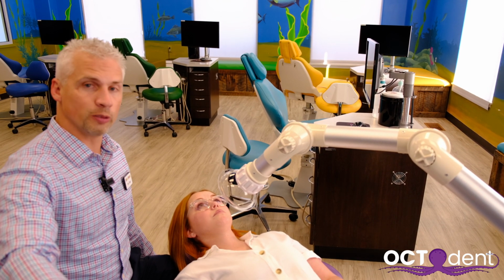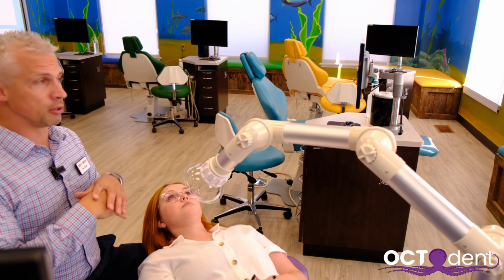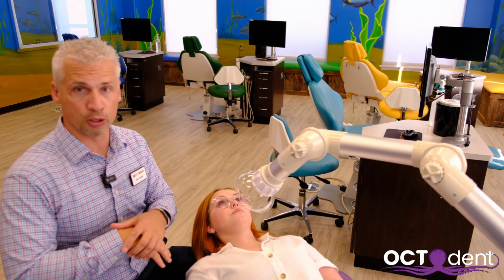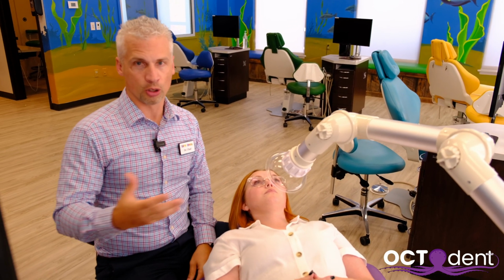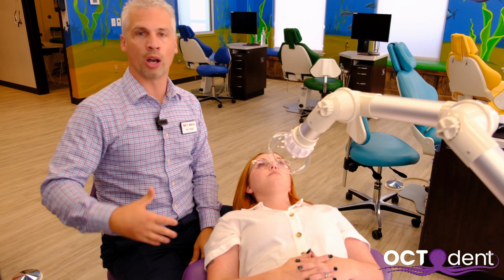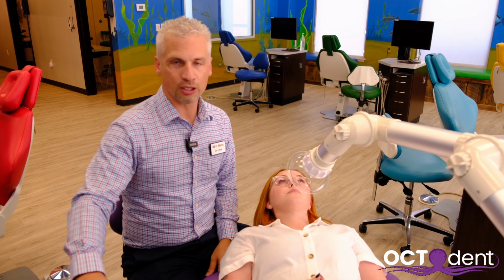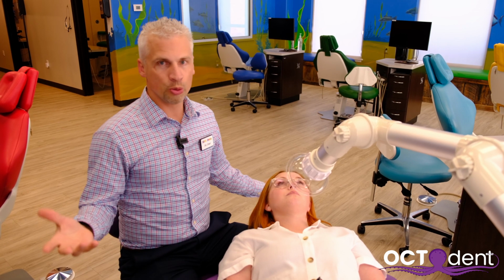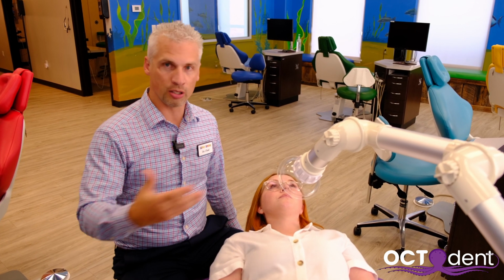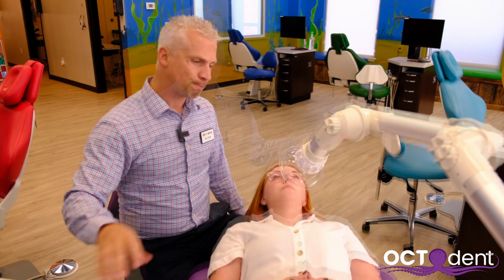So it's just sitting over here with my barrier, and then I'm able to fill the tooth, I'm able to seat the crown, I'm able to do whatever I need to do, but I don't have to have the unit on the whole time. I just have it on while I'm drilling. If I need to say something, I just simply turn over and turn the unit off, and then when I'm ready to work again, I simply turn it back on and go back to work.